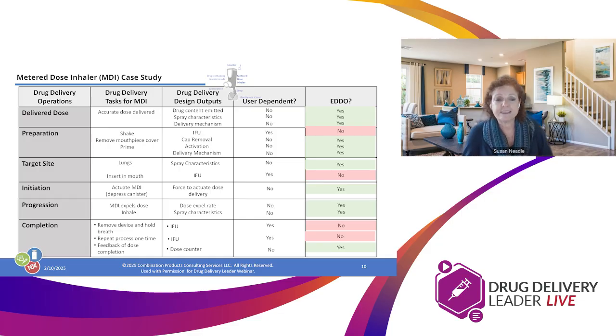Then when I'm progressing through my dose, the metered dose inhaler expels a dose of the drug and I inhale at the same time. So the dose expel rate and the spray characteristics would be two different drug delivery design outputs, neither of which is going to be user dependent, and therefore they are EDDOs.